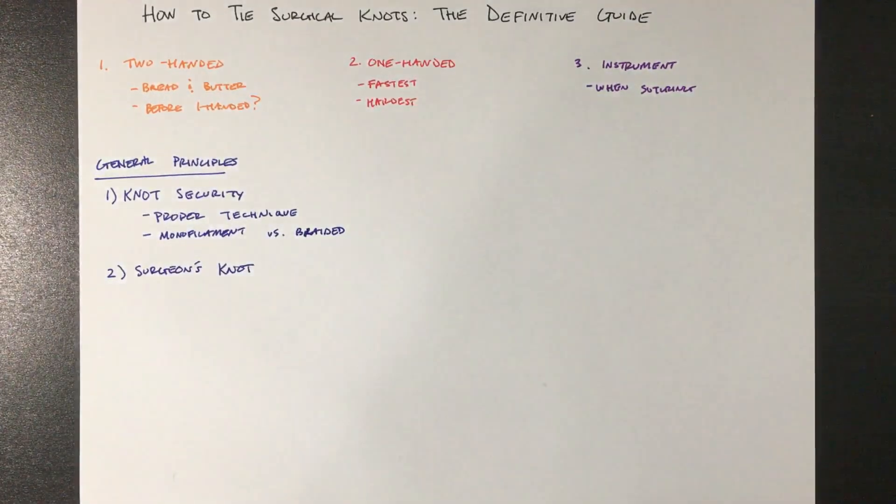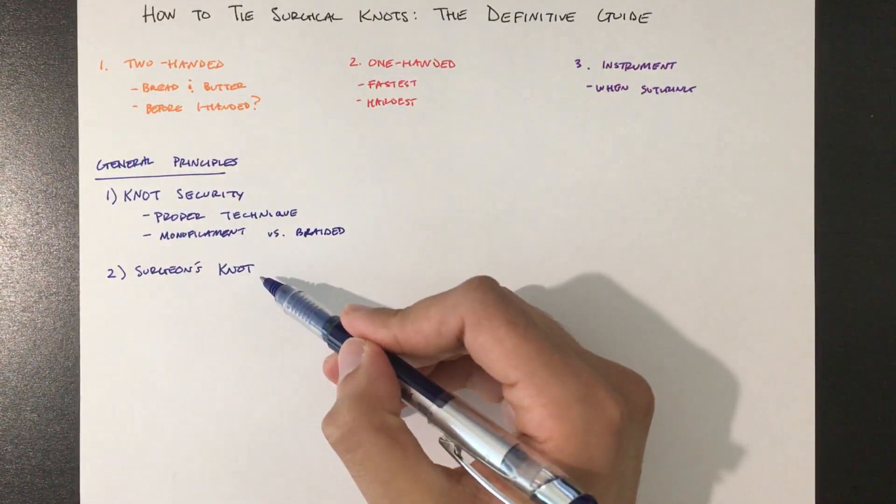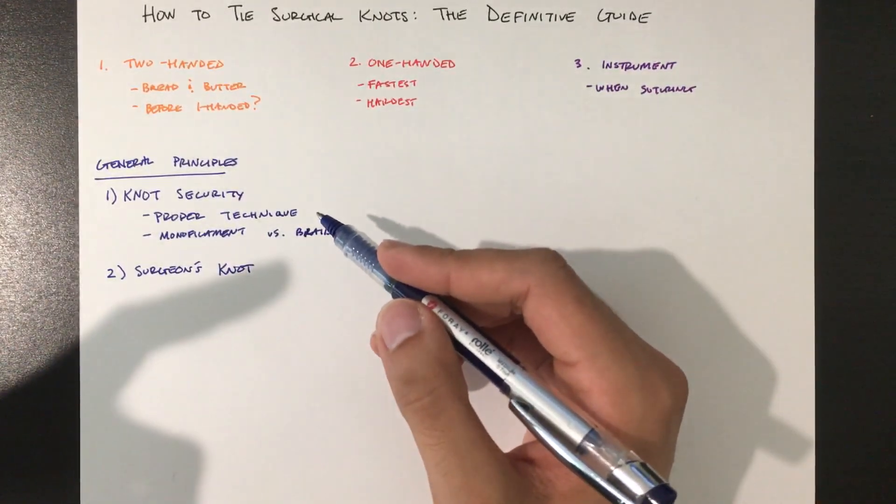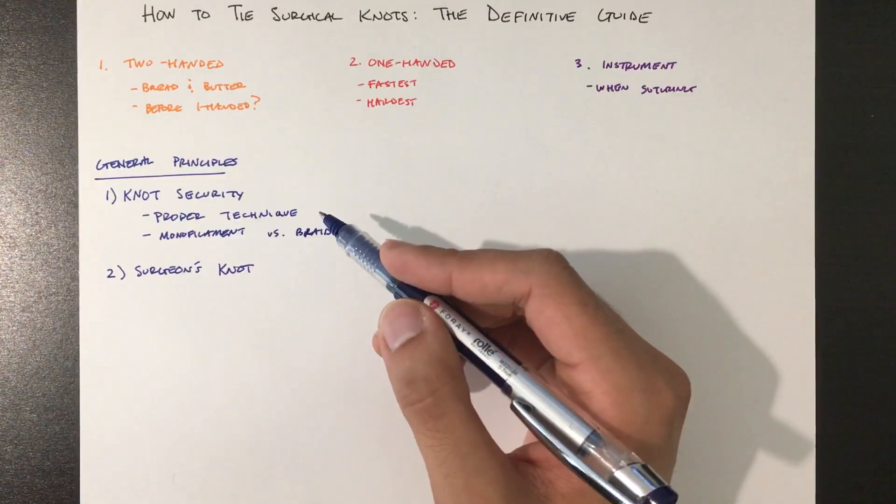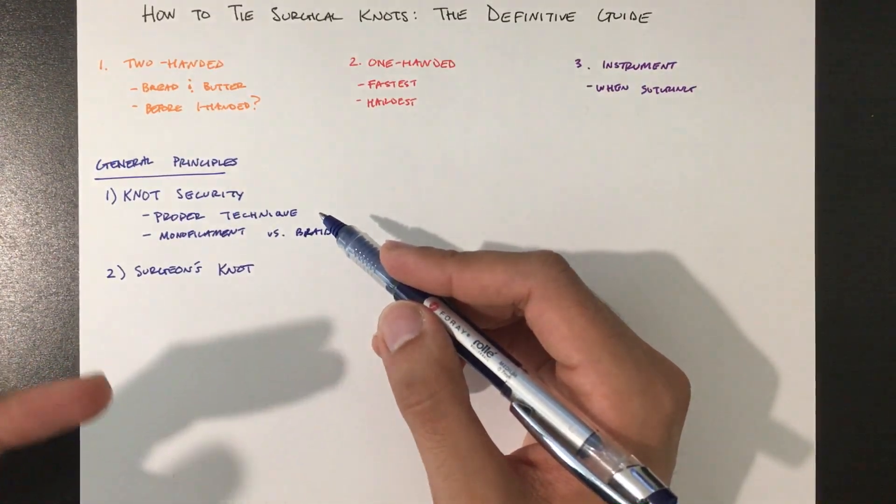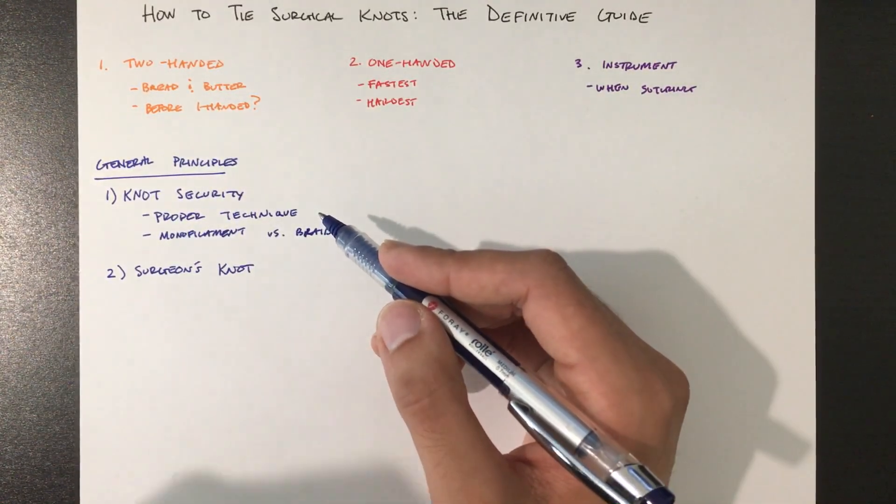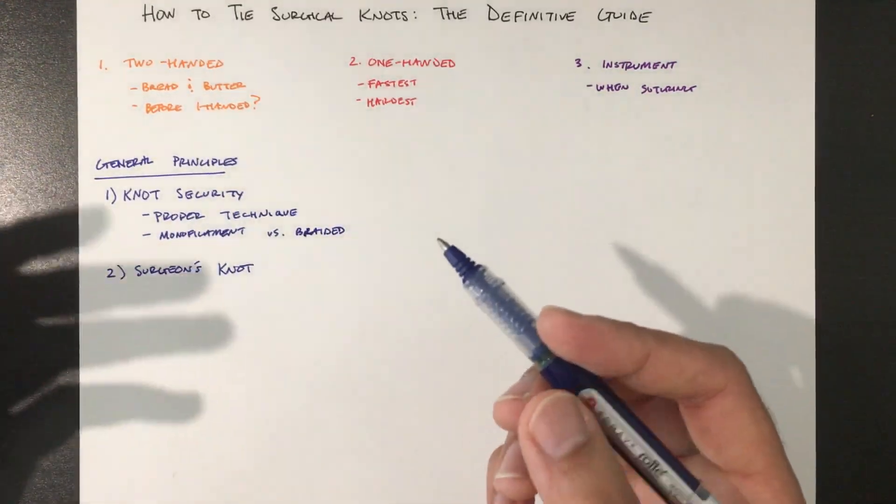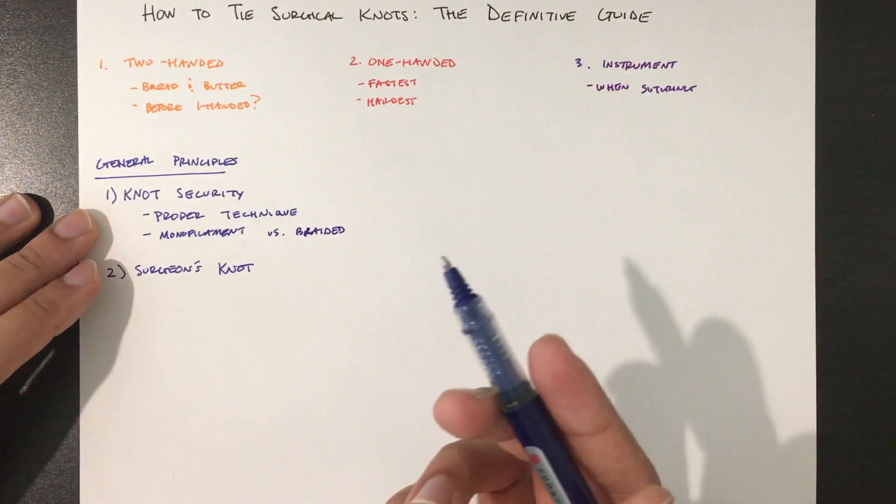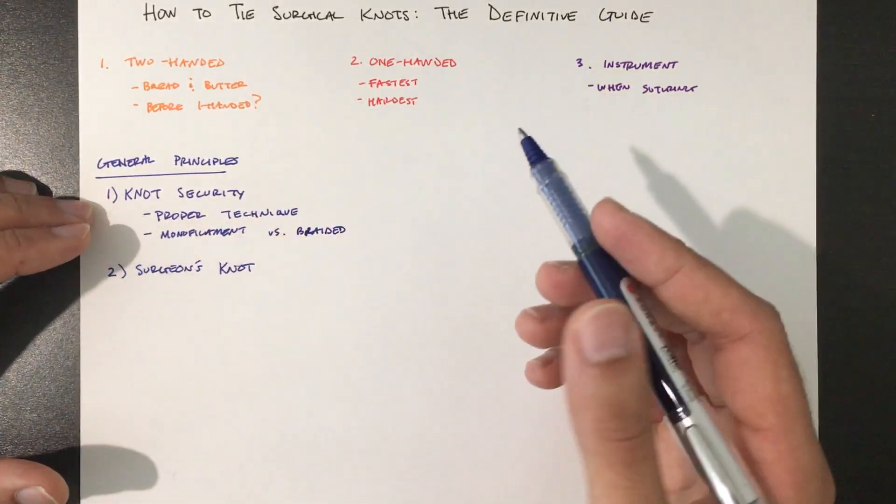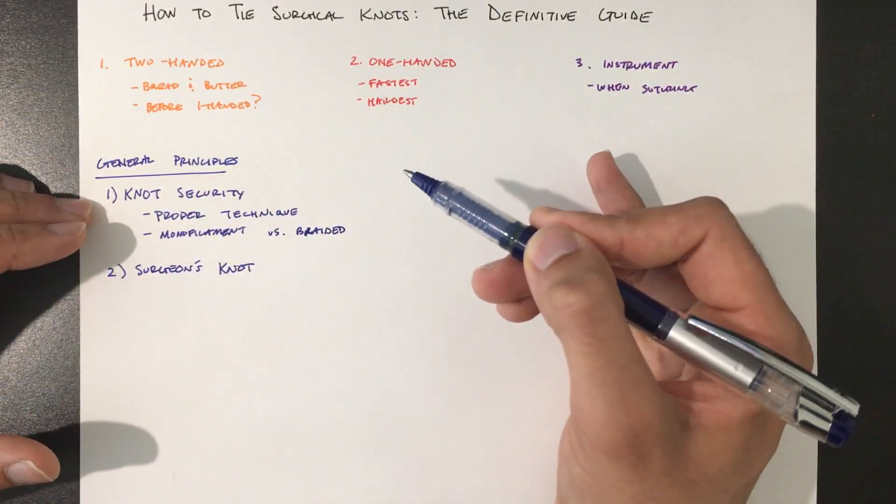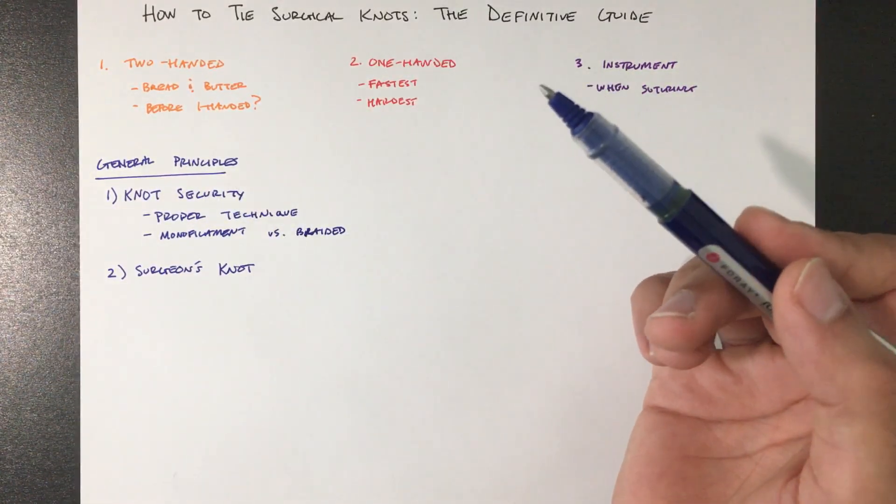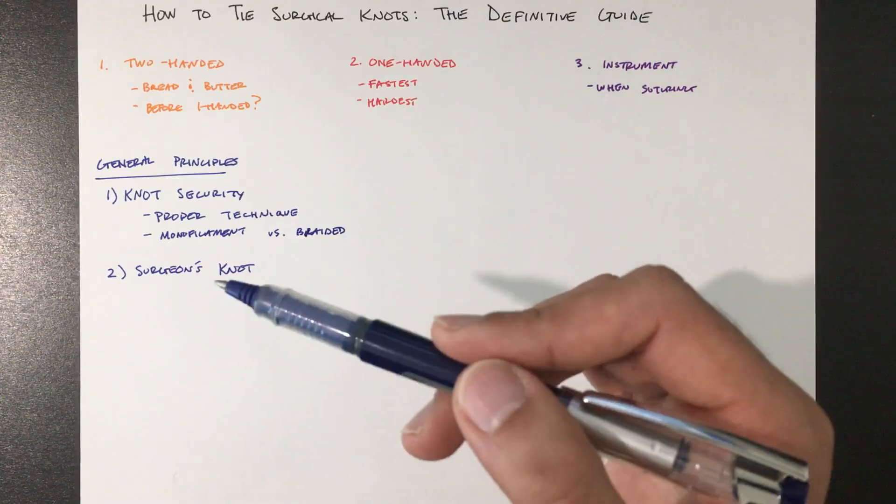The surgeon's knot. Sometimes you should use a surgeon's knot, but not always. All it is is during the first throw, you loop the suture twice in the same direction. This allows you to tie under tension and prevent slippage, so that when you lock it by throwing in the opposite direction, it prevents an air knot. Why do you not always use it? Because excess material. Generally speaking, you want to use the least amount of suture possible to achieve a secure knot. Excess suture will either irritate the patient if it's above the skin, or if it's below the skin, it will increase inflammation.